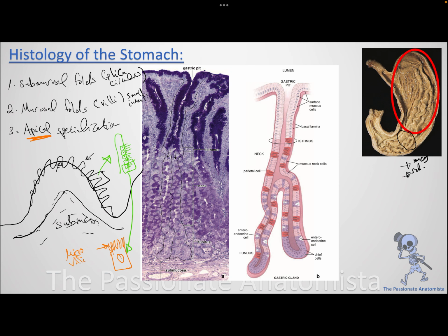If you look at the stomach, you have your simple columnar cells, and that is what we call the gastric pit. Okay, they make foldings, because here I need to have a cavity that will receive the nutrients and the enzymes from all of these cells, and take them all the way to the lumen to get exposed to the food itself, to do the absorption or the digestion that I need.